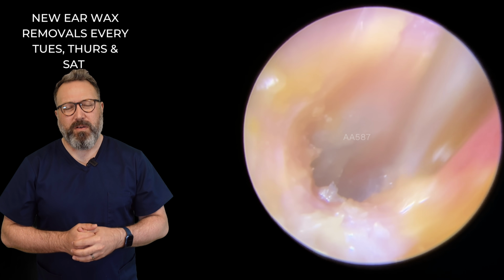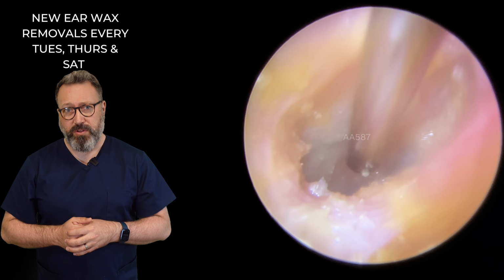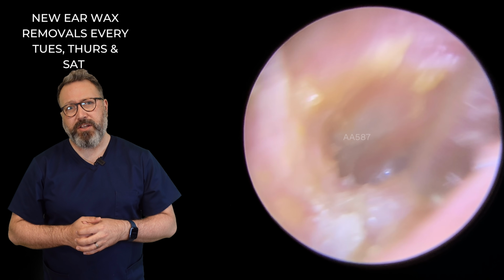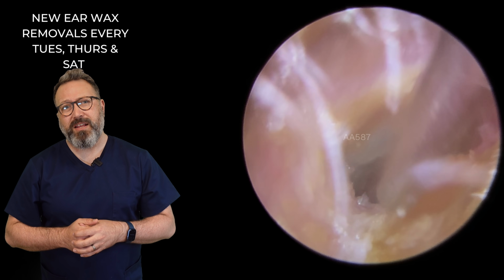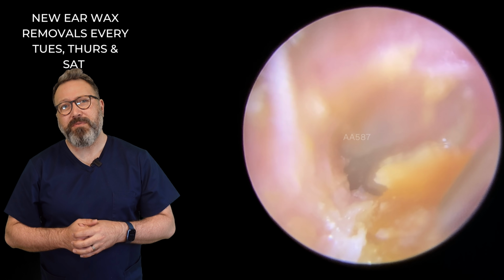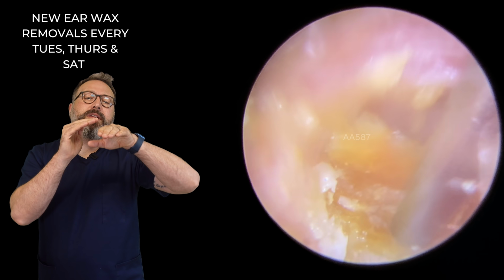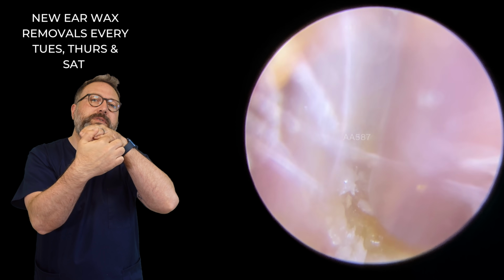You can see a lot of blurring to the camera as well, and that's because of the amount of olive oil we're putting in there. So we've got this last section here down at the bottom. You can see I'm trying to lift that up. There we are. You can see that long plate that was hidden. It's not uncommon, just as you go into the canal, you've got a little dip just there, and it's not uncommon to get bits that come right up to the edge here.